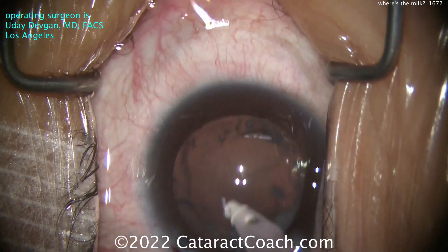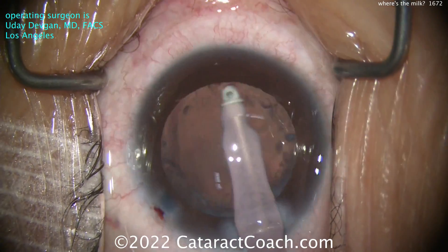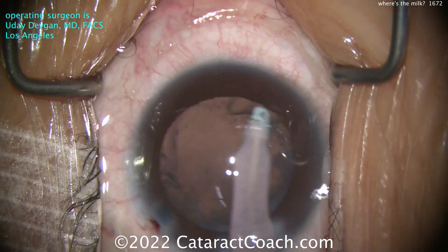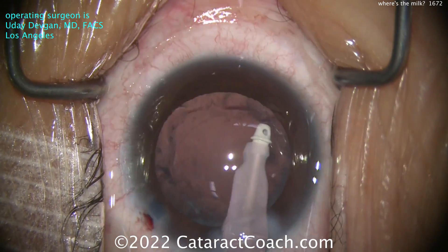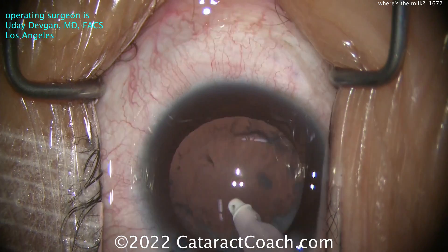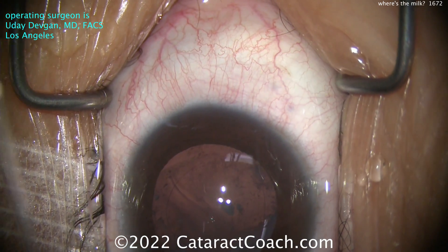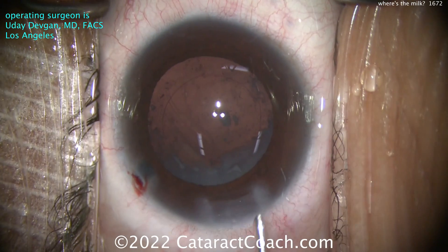There are some vitreous floaters - that may be a big PVD. Trying my best to clean this up; no zonular weakness that I can detect. A little aspiration here, trying to polish that undersurface of the capsular rim to get out this opaque scarred cortex material that's on the lens capsule. You're not going to get it all out and that's okay.